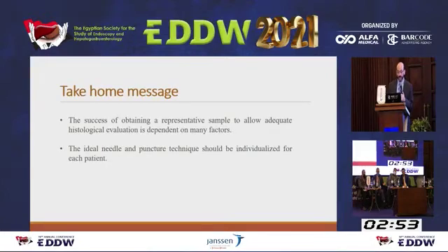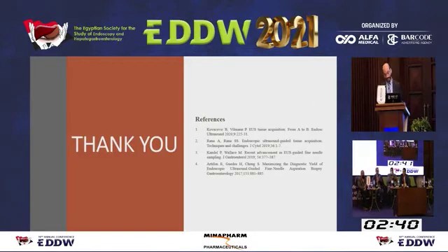So to take home message, success of obtaining a representative sample depends on many factors, not only one point. And the ideal needle and the puncture technique should be individualized according to each patient. And thank you.